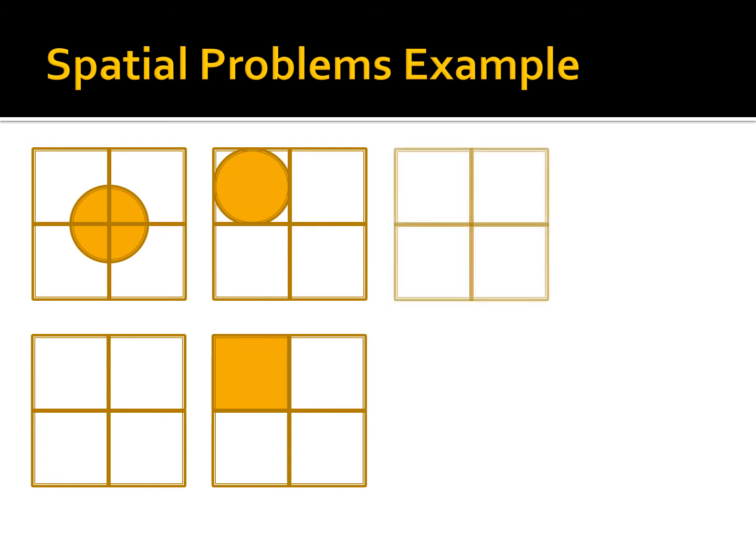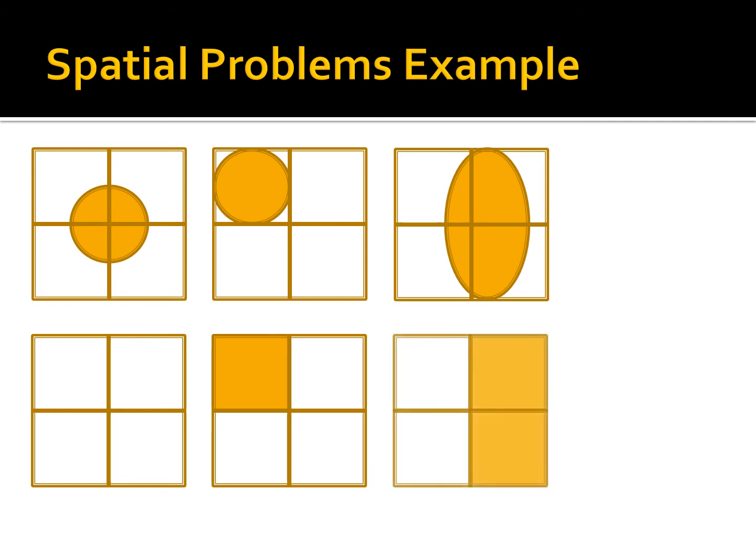This oval spans 1 pixel wide and 2 pixels high. What is the likelihood it will be recorded? The likelihood it will be recorded is very high because it spans 2 pixels and is sure to cover one of the 2 and more likely be recorded. If the object were a 2 pixel line, coverage of 1 or 2 adjacent pixels is a certainty.